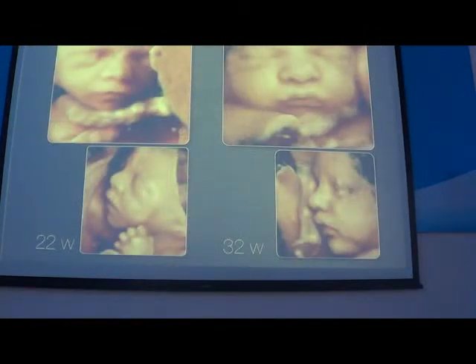You have to know also the different aspects of the baby in the second trimester and in the third trimester. In the second trimester, it's not possible to see the eyelid. And the exophthalmia is normal at this stage of pregnancy. And this is a normal aspect at 32 weeks. The baby is fatter and we can clearly see the eyelids.